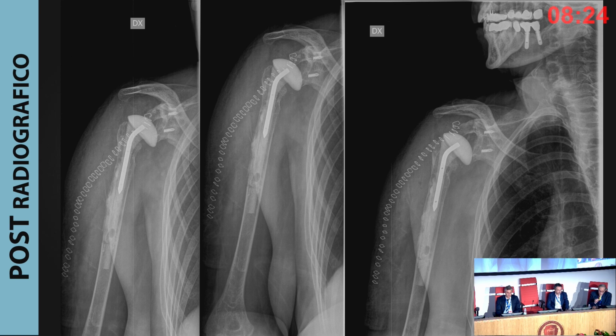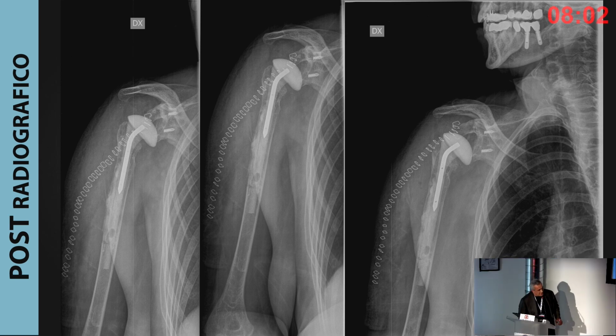Angelo, Giovanni, one extremely satisfying spacer. In my career, I remember patients who, after this procedure, healed after 6 months with not a good movement, but no pain, no infection, and she didn't want a revision, and she is happy after 3 years with the spacer.